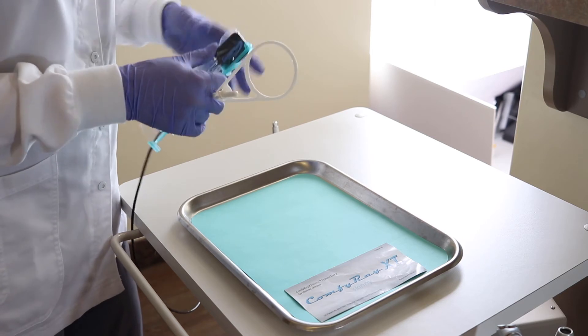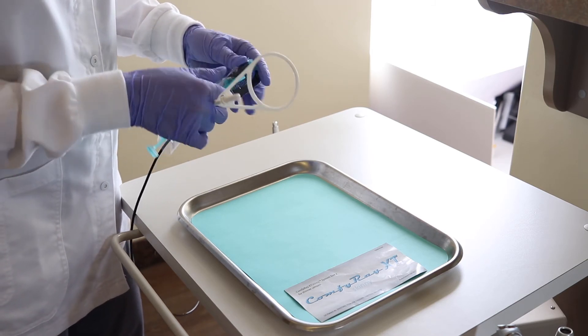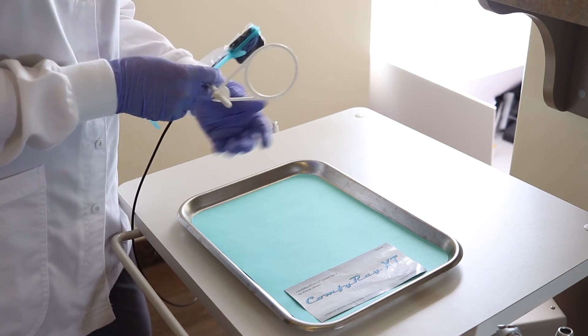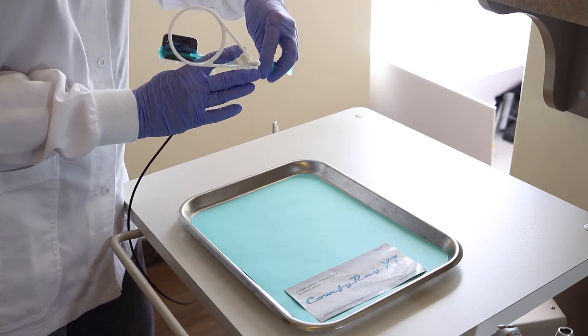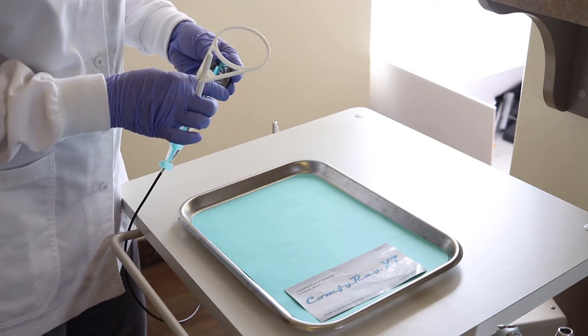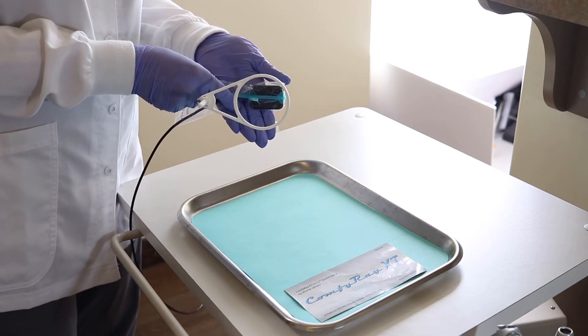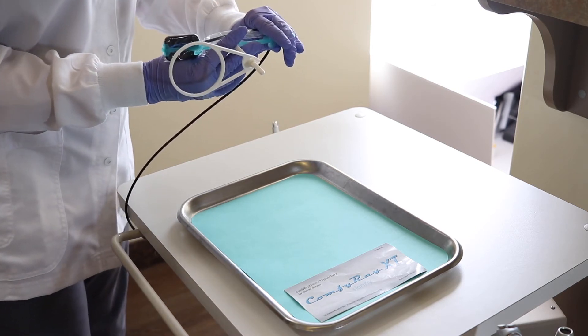Now we're going to click the ring down and slide the sensor all the way down. We'll take two lower posteriors, flip it over and take two upper posteriors. Now we're going to go for our bite wings — put it in the middle, click the ring in the middle, and you'll take bite wings, then flip it over to take bite wings on the other side.